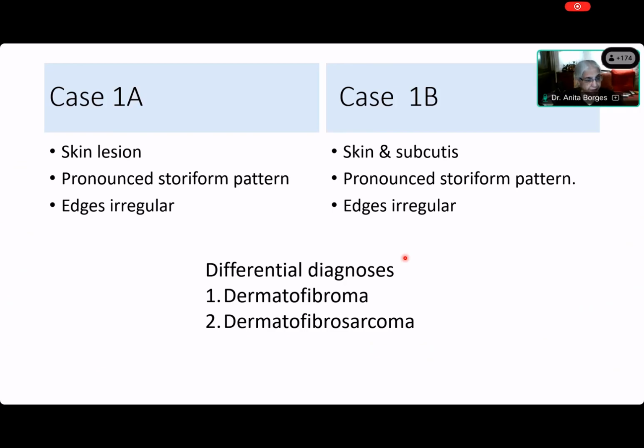A or B? Ma'am, 1B is clear because it is well circumscribed and dermal based, though we cannot see the infiltrative edges. Okay. So do you think anything in the dermis is ever well circumscribed? Have you ever seen or heard of a storiform lesion that is well circumscribed? No, the edges are always irregular. Okay, so it's nothing to do with circumscription. All right. Yes, tell me. 1B is dermatofibrosarcoma because there is infiltration in the subcutaneous. Infiltration into subcutaneous tissue. Achha.